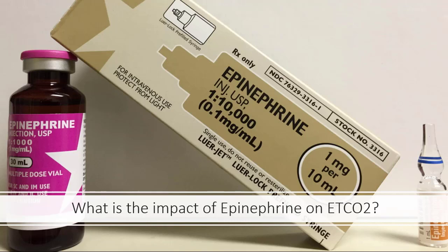What we think is that the pulmonary capillary bed is especially prone to the vasoactive effects of both epinephrine and norepinephrine, having a lot of alpha receptors. Whether this has an adverse effect on resuscitation is an excellent question. Even though it's been almost 30 years, they're still trying to figure out the relationship. But what you will see is a decrease in your end-tidal CO2 within 1 minute of epinephrine administration, which should resolve very quickly.